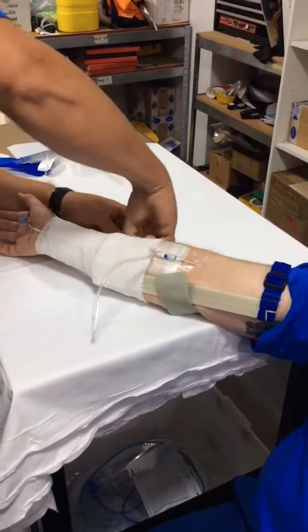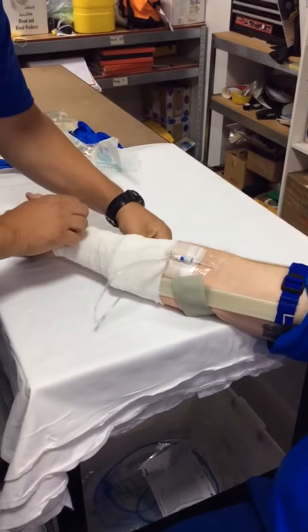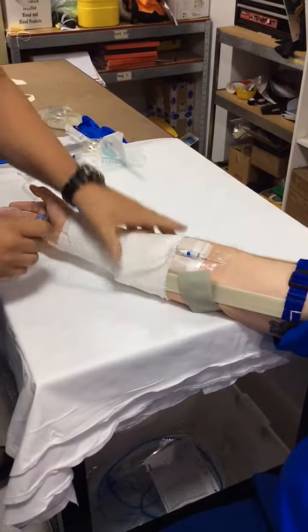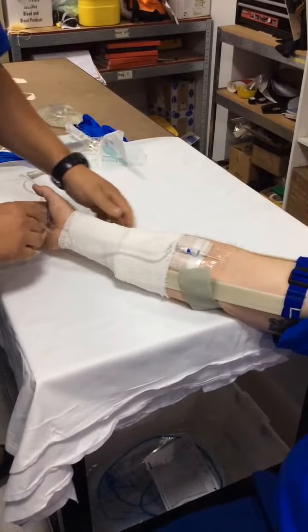Securing that doesn't have to be fancy — you can tuck it back inside the roller bandage itself. It's not tight, it's not constrictive. It's just securing the line.